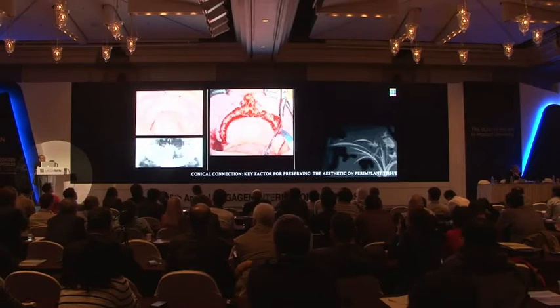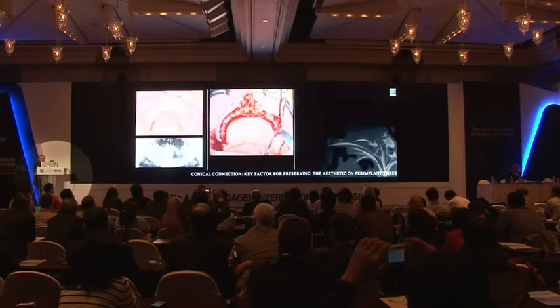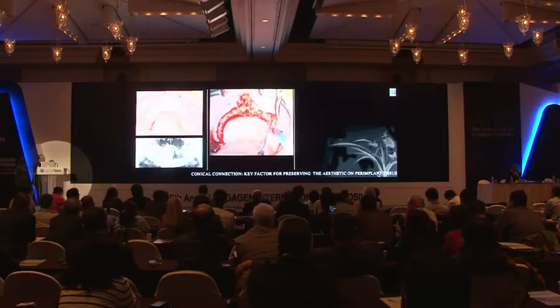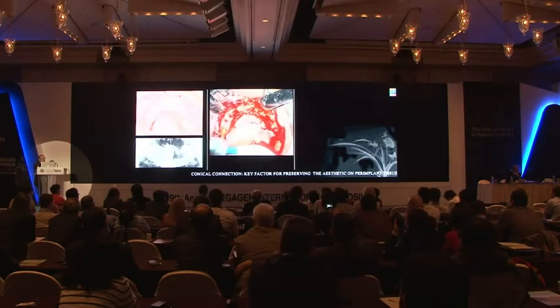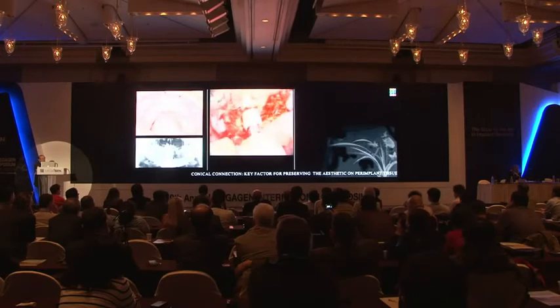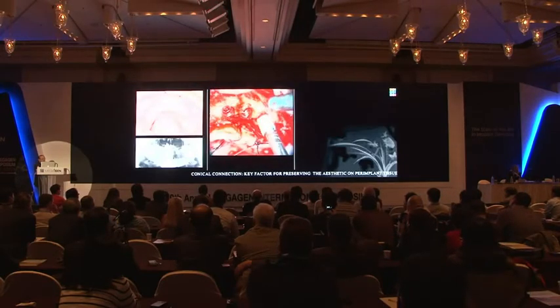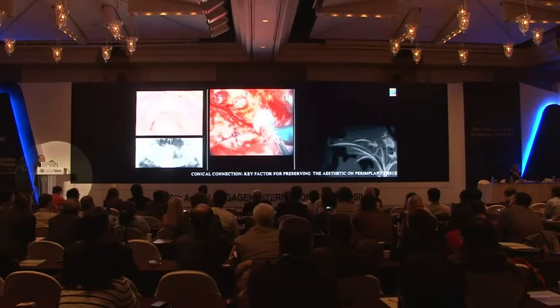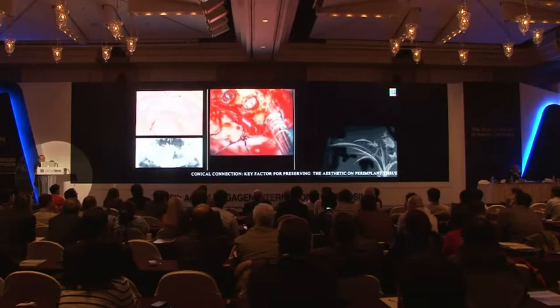Now we are going to see the last two cases with two different prostheses, because they had two different starting conditions. In the first case, even if we have an optimal clinical condition, the patient had a total removable denture for many years and had already lost much of the vertical ridge dimension.